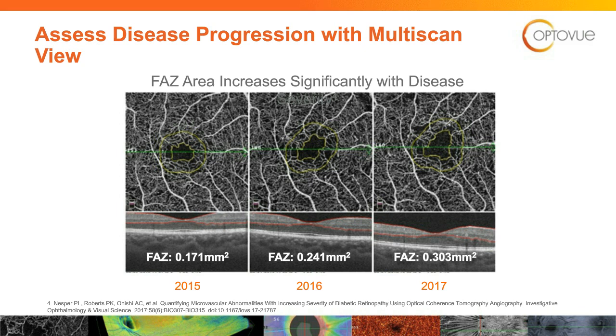So remember the different retinal layers, and this is the beauty with OCT angiogram, is you've got different retinal layers, and you can detect an anomalous vessel in the superficial capillary plexus versus the deep versus the outer retina. If you are seeing an anomalous vessel in the retina, meaning in the deep capillary plexus, maybe the superficial, but more likely the deep capillary plexus, and you're seeing, boy, that vessel looks weird. That shouldn't be there. That looks abnormal. That could be IRMA. IRMA is intraretinal, meaning it's within the retina, versus neo.